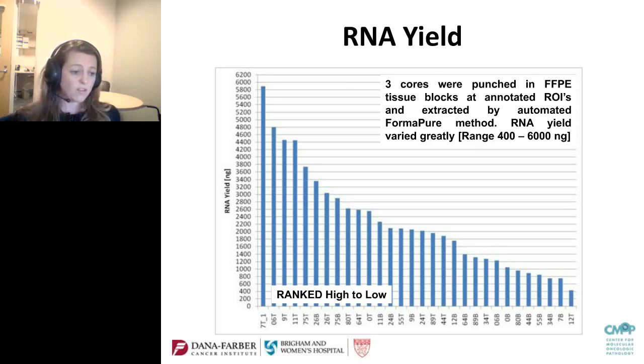And some of this is due to tissue morphology changes as you core punch into a block, but a lot of it is due to that these blocks are not all centrally stored. They can be stored in various different places. So they've undergone degradation due to humidity, heat, and just general slow degradation of nucleic acids over time. And so what you're seeing here is representative of the type of samples we're trying to establish methods for.